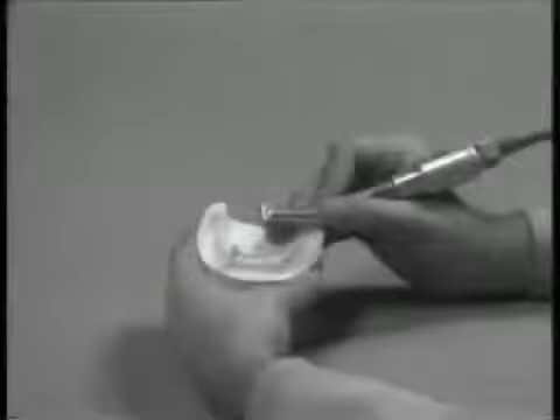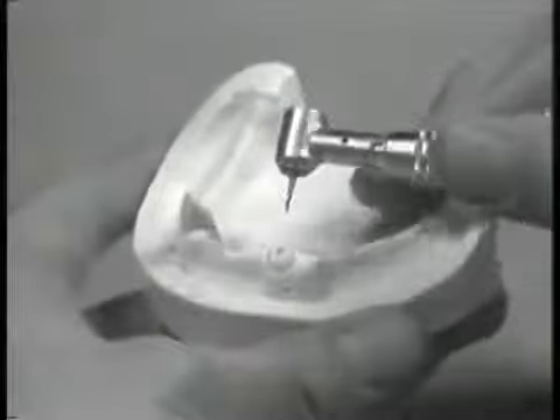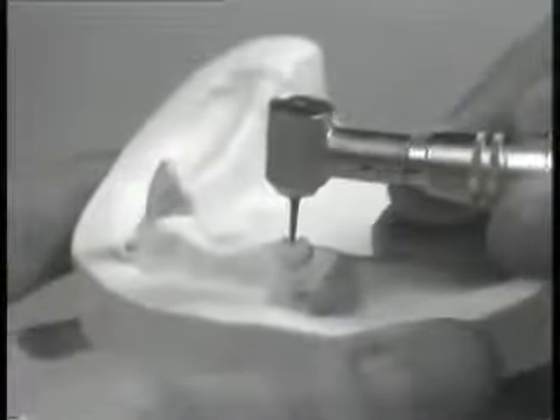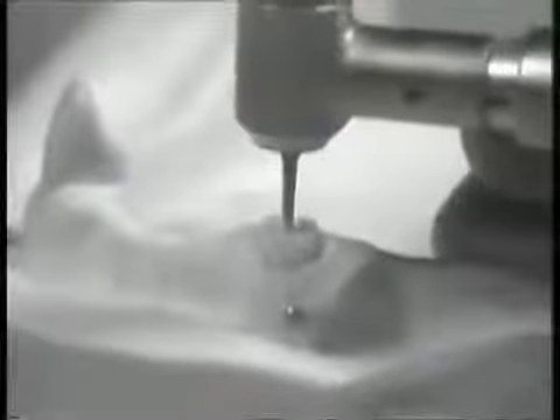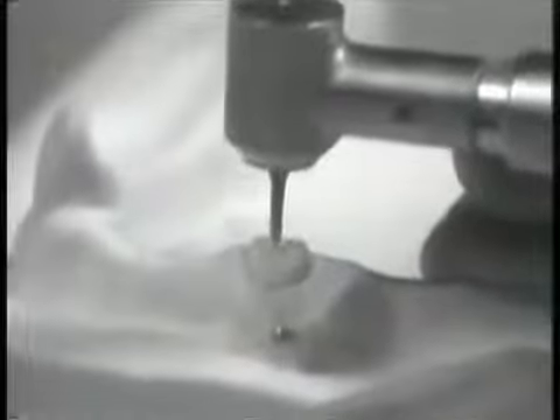A tapered fissured bur is next used to produce an anti-rotational lug. The lug should be placed into the area of the greatest exposed root area so as not to encroach upon the lateral root surface. The anti-rotational lug will prevent rotational displacement of the finished coping. The root preparation is now completed and the laboratory phase of coping construction will be demonstrated.